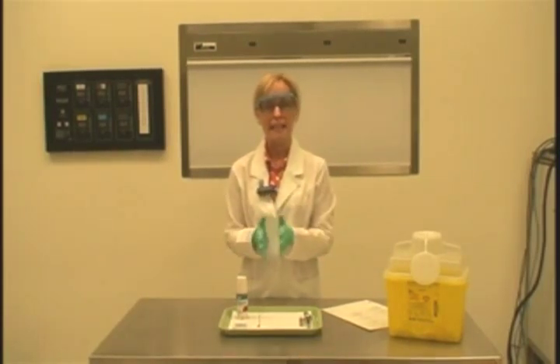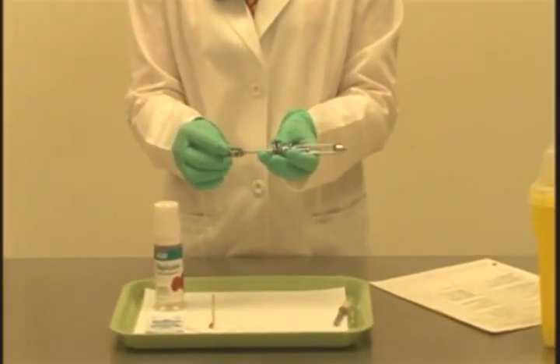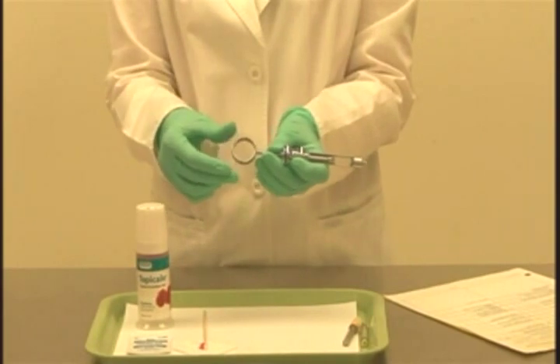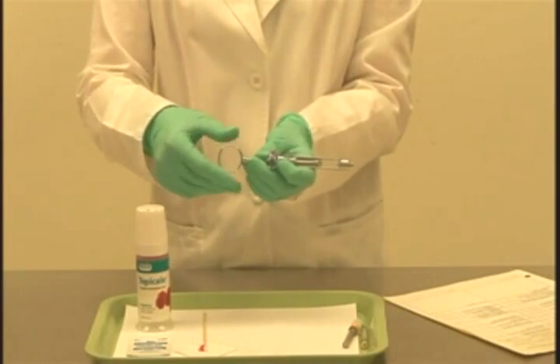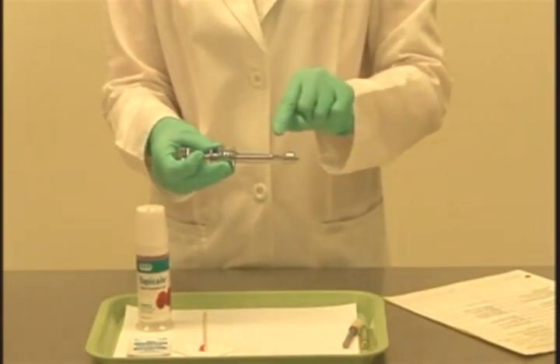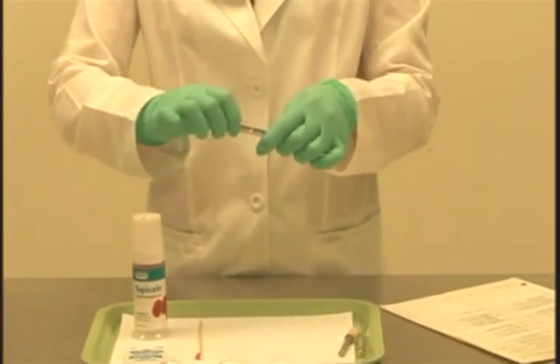Now that we have our protective equipment in place, we're ready to start the procedure. The first thing is to ensure that the local anesthetic syringe is intact — meaning all four parts are tight. I have the thumb ring here; it can get loose with repeated use, so I'm holding the piston and making sure the thumb ring is tight. The finger grip can also get loose, so I'll tighten that. There's a little knob at the end of the piston — I want to make sure it's tight. And at the very end we have the threaded needle adapter, which I also ensure is tight.